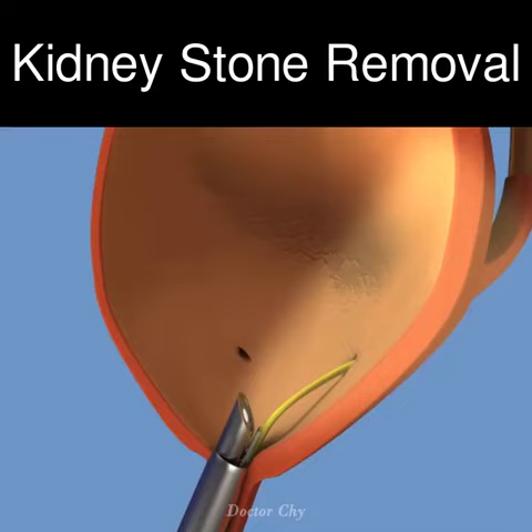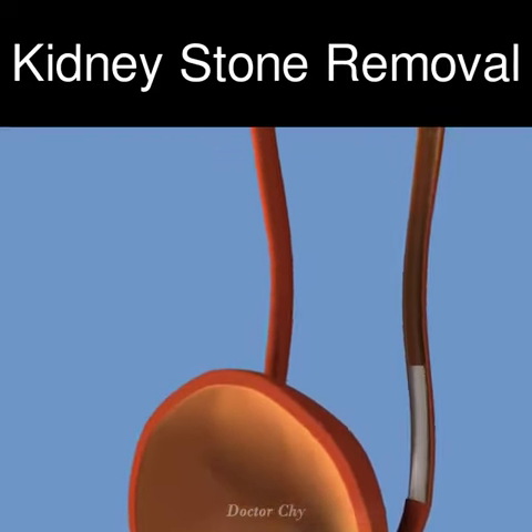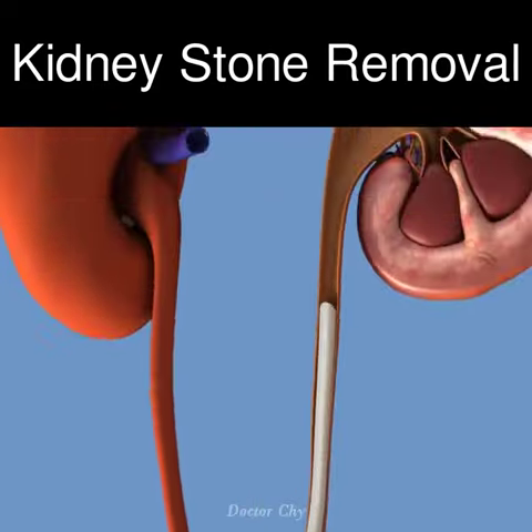A contrast study may be performed to assess the anatomy of the renal collecting system before stone removal. A contrast agent or dye is administered through the tube into the ureters, and X-ray images clearly outline the urinary channel and exact position of the stone.